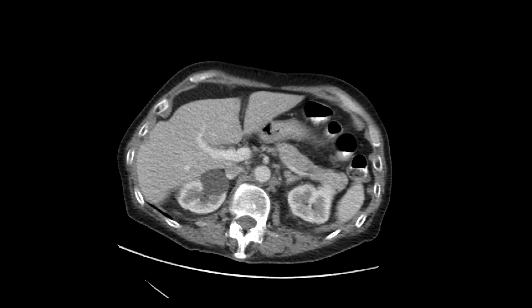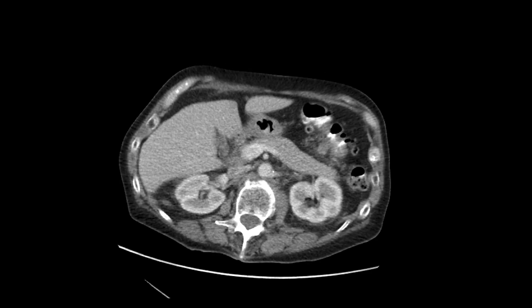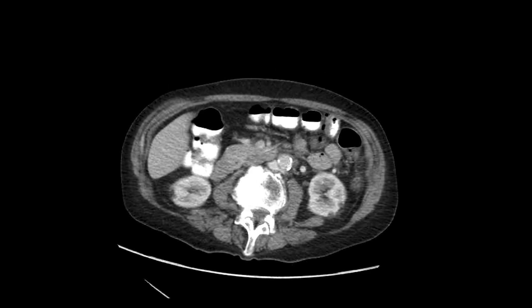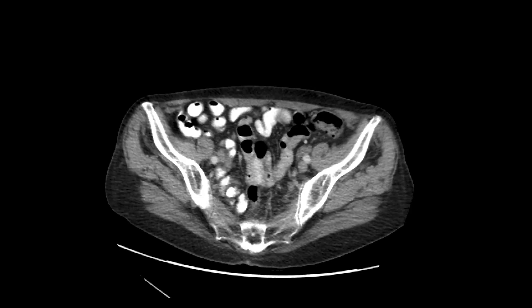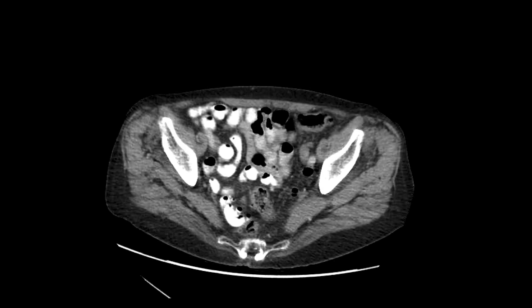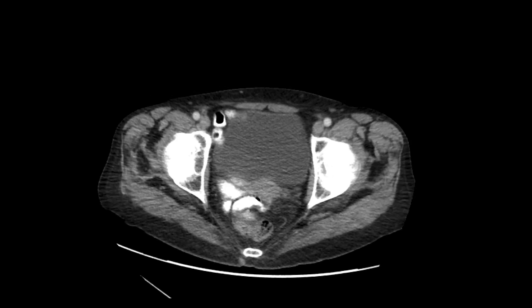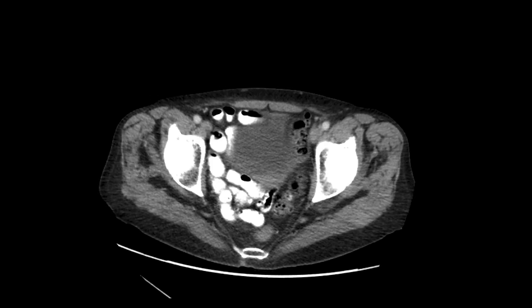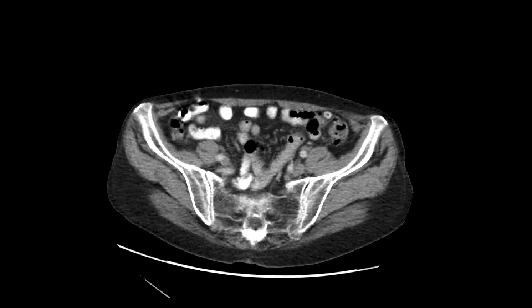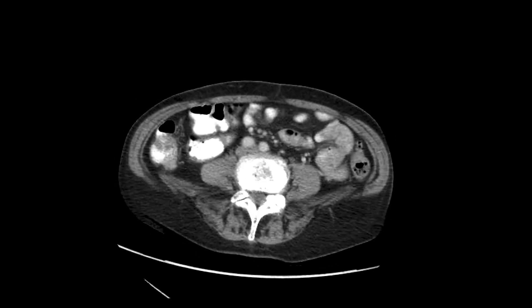I'll just start scrolling through the images to see if you can pick up on the abnormality. This was a pretty good pick-up by one of our junior residents who previewed this case and read it out to their attending.